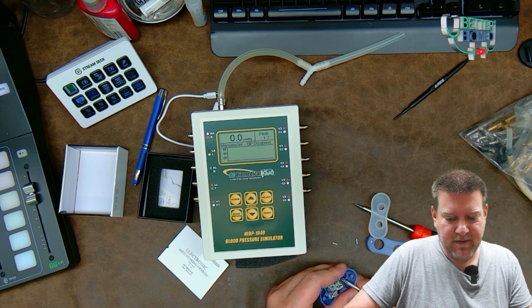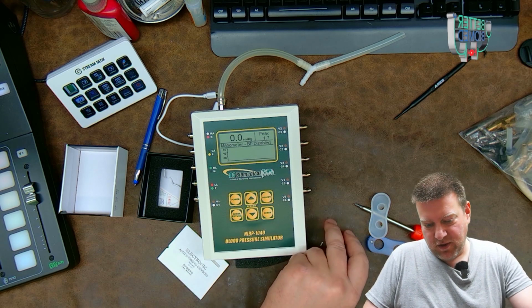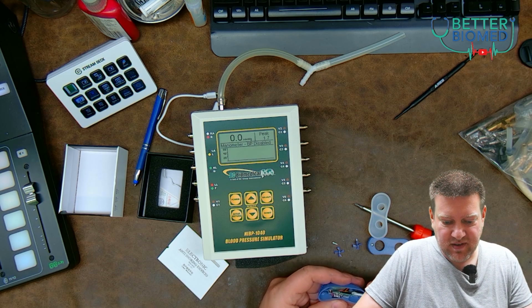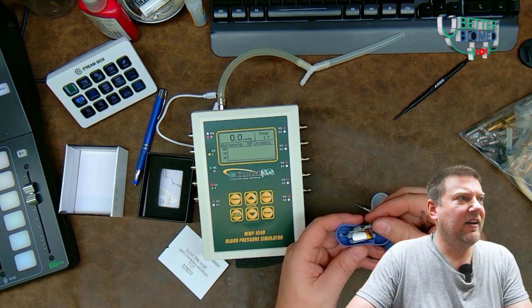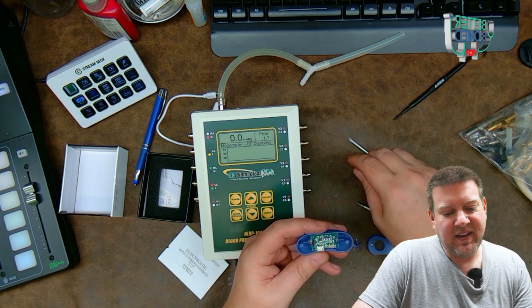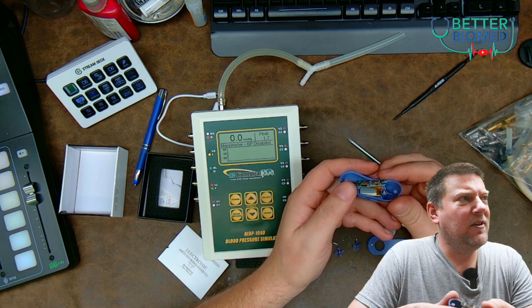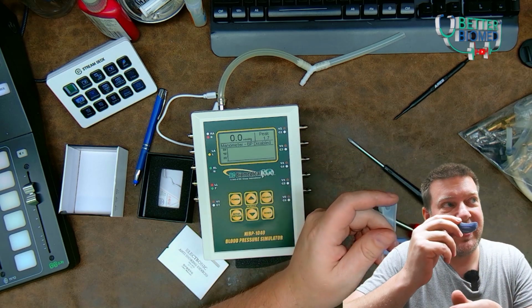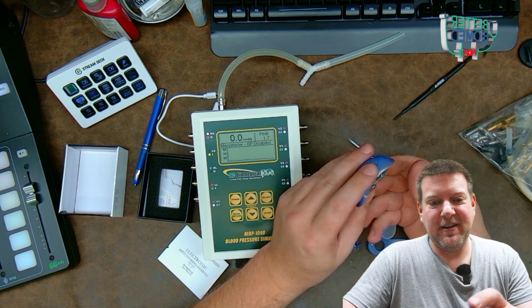Because imagine if the little fan just popped right off. That's cute. Imagine if the little battery that's in here leaked any sort of fumes or whatnot, which we know lithiums have a tendency to do. Oh, yeah. And it's not even like a good lithium right there. You see the little lithium polymer cell in there. Guys, what can I say? This little thing right here, if that guy puffs up whatsoever, do you really want this right here where you're going to inhale whatever it's giving off? Definitely not, folks. Definitely not.